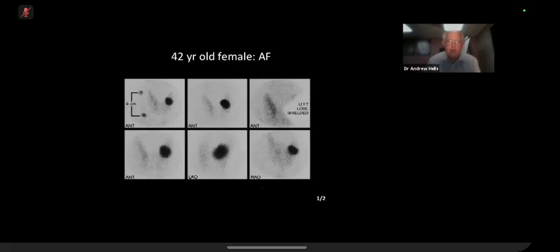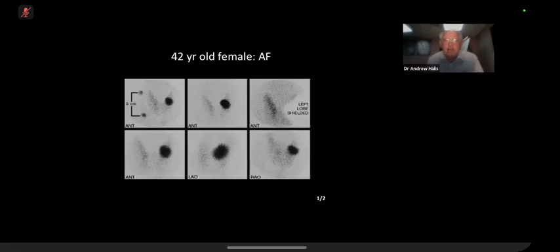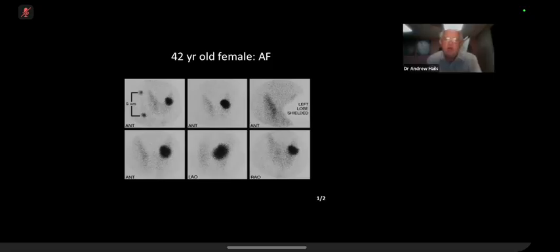Hello? Can you see the slide? Yes, I can. Is it a 42-year-old female with AF? That's right. So what's wrong with them?